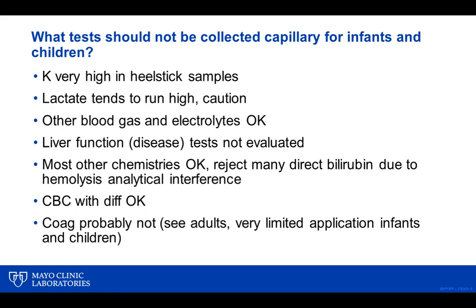So what tests should not be collected by capillary sampling for infants and children? Again, potassium, I mentioned. We choose not to report that. You could try to do it if you define an H index in your lab that you feel comfortable with that would avoid what we call pseudo-hyperkalemia, reporting falsely high potassium results.